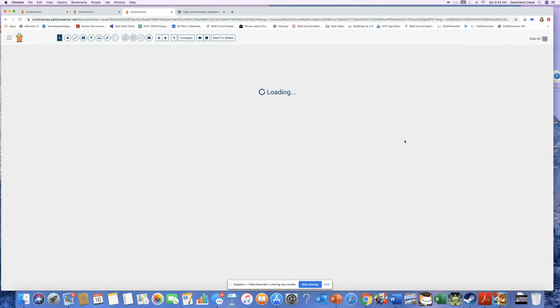I'm just loading the next, sorry, I have to upgrade my internet here. Loading the next image.